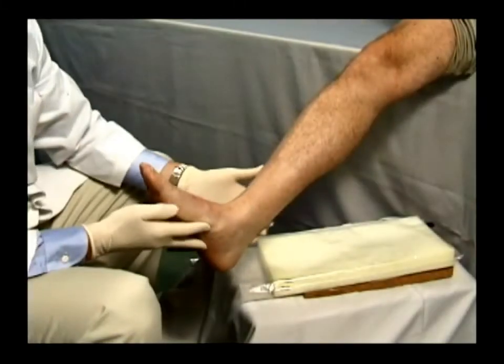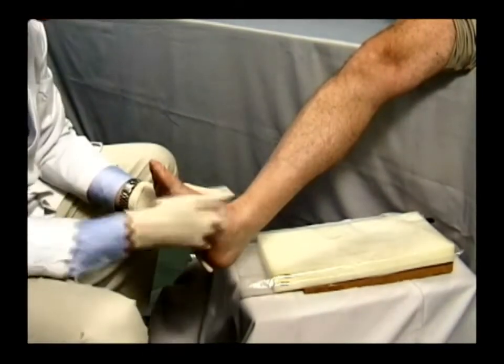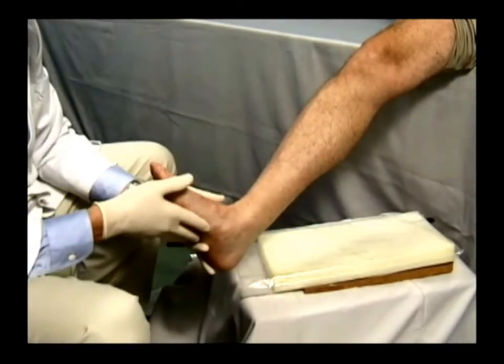To begin the molding procedure, position your patient so the foot can be maintained at a 90 degree angle to the leg. In most cases, the patient can hold the foot in this position during the preparation phase. However, for those individuals with a spastic or flaccid paralysis, you may need assistance from staff personnel to hold the foot and leg in this position. Holding the foot in this position will prevent movement of the protective plastic cutting strip and channel tube after they have been applied.